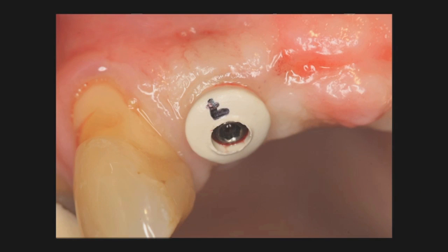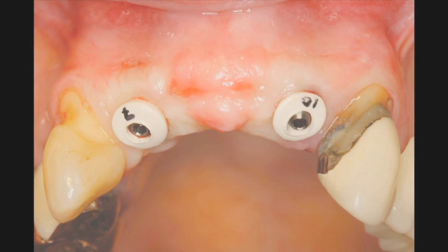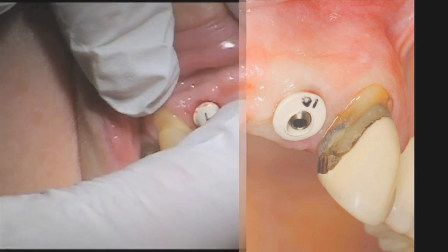You can see there's very little bleeding, nice tissue contour, and the laboratory pre-contoured or prefabricated these transitional healing abutments to allow for some soft tissue contouring immediately following surgery.